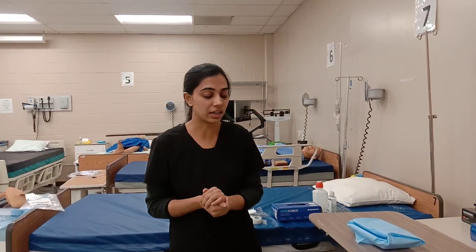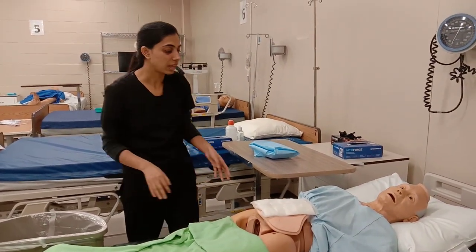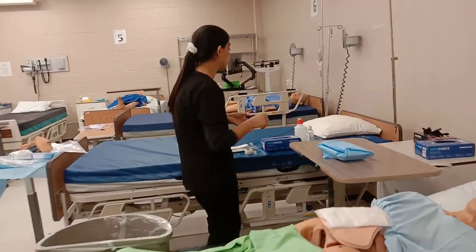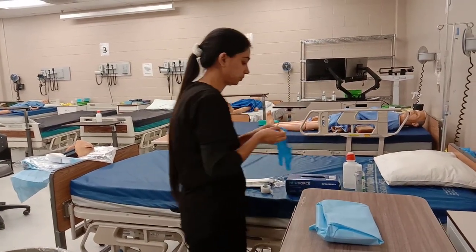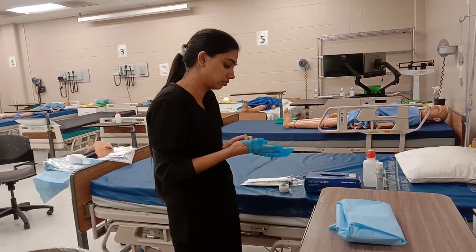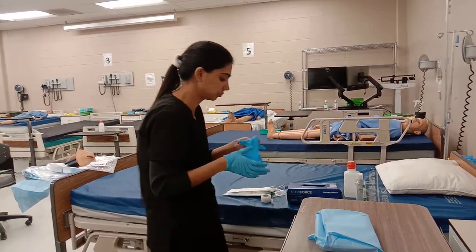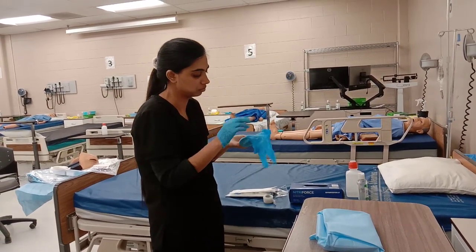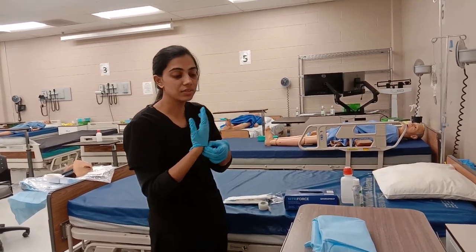Now I'm going to manage my environment. I'm going to elevate the bed to my appropriate height. I'm going to reposition the patient. I'm maintaining the privacy. And now I'm going to perform the hand hygiene again. Now I'm going to put on my gloves. So I have put on my gloves.